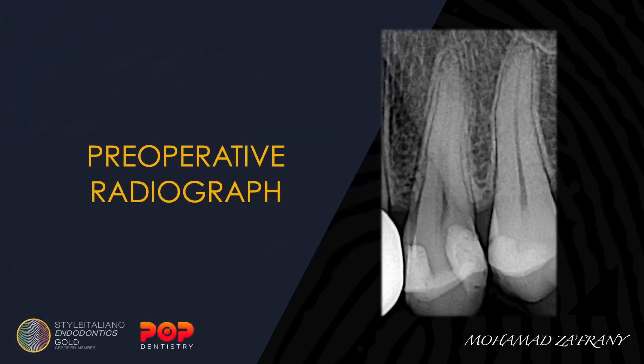This is the last case for today — root canal treatment to tooth number 24 with symptomatic irreversible pulpitis and a normal periapical area.